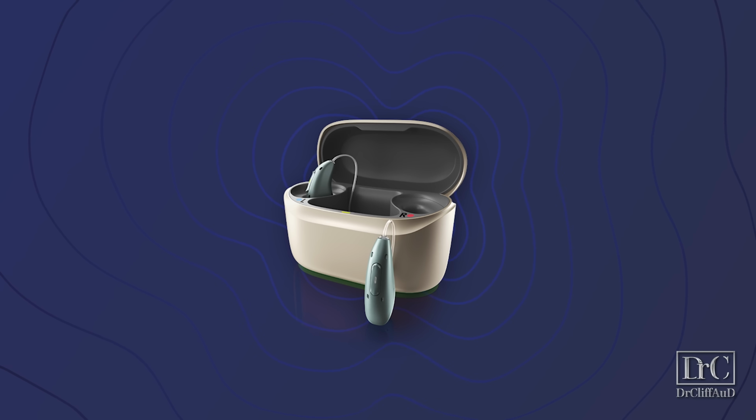And at least with the Lumity devices, I could take an older generation charger, even 2 generations back, and use those for my patients who needed a custom ear mold and their custom ear molds wouldn't fit inside of here. But what the heck am I supposed to do with this now? You can't use a previous generation charger for these Infinio hearing aids. I'm not saying it's impossible to fit custom ear molds inside of this charger, it just can be very difficult depending on the size of your ear molds.